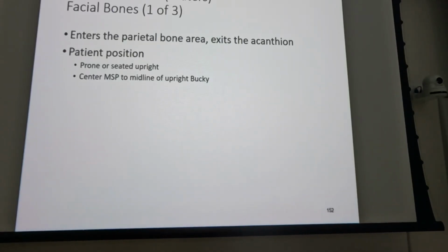What we've got there is that 37-degree angulation, which is the angulation between the orbitomeatal line and the image receptor. Okay, this confuses a lot of people because if you flip back over to the Caldwell, 15-degree Caldwell, what forms that 15-degree angle?